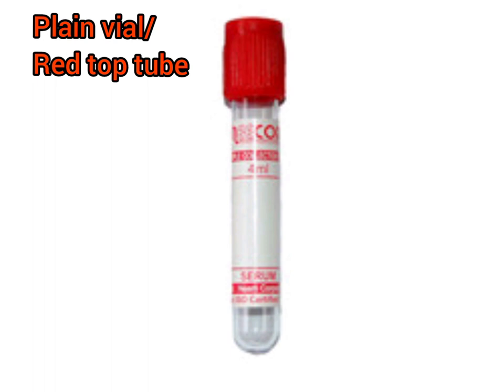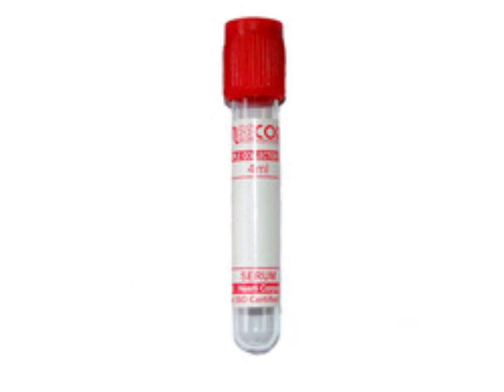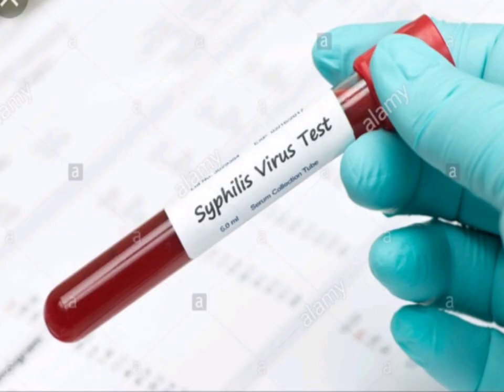Let's start with the plain vial or the red top tube. As you can see in the picture, the red top tube is used for biochemistry tests which require a serum sample. The additive is nothing in the plain version, but in some cases it contains silica particles, which act as a clot activator. It is used for serum testing.